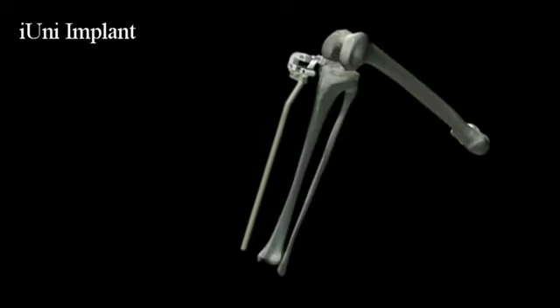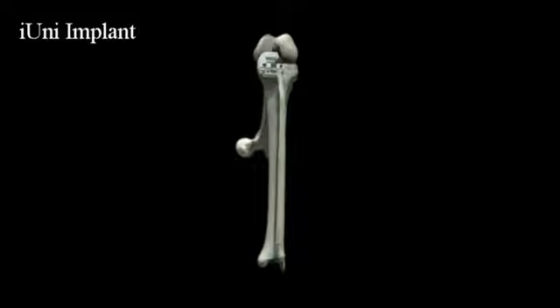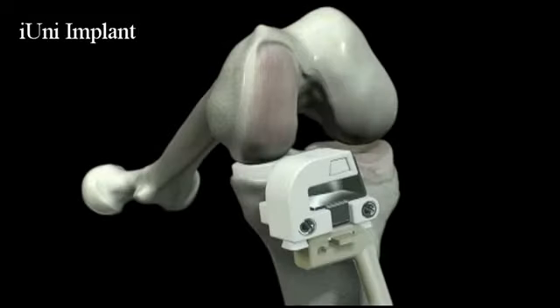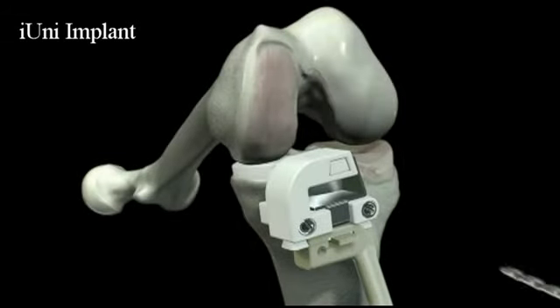Step 3. Tibial cuts. With the leg in flexion, slide the tibial iJig onto the post on the front of the balancer chip and seat the tibial iJig flush against the anterior tibial surface. Drill and pin both holes on the tibial iJig and remove the tibial alignment rod if desired. Perform a sagittal tibial cut using the tibial iJig.